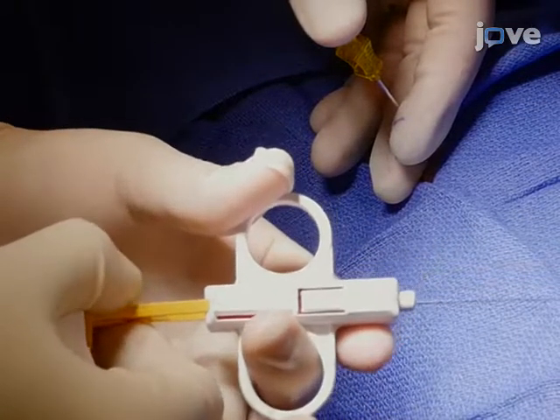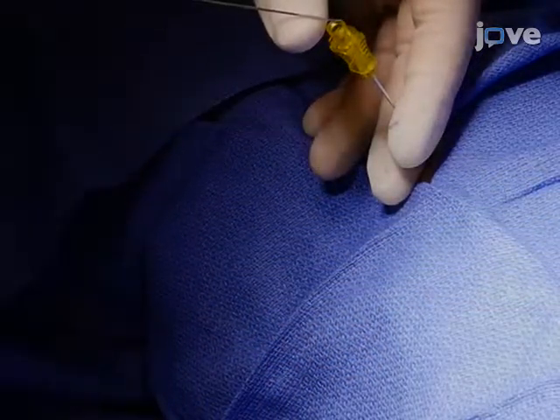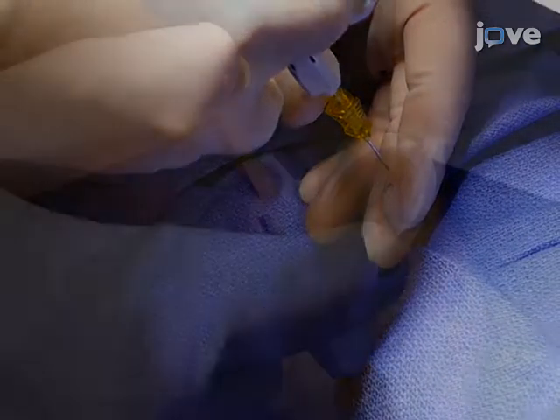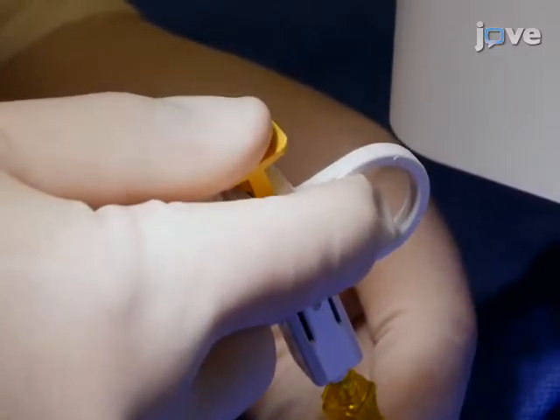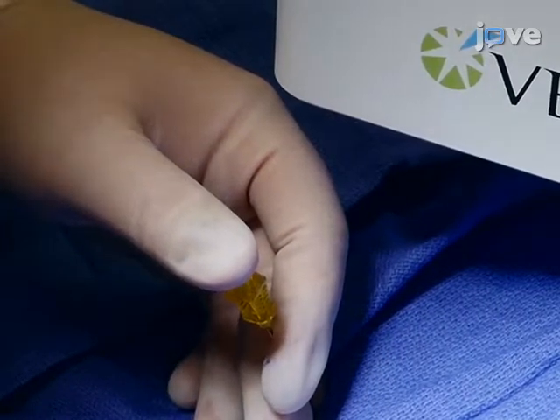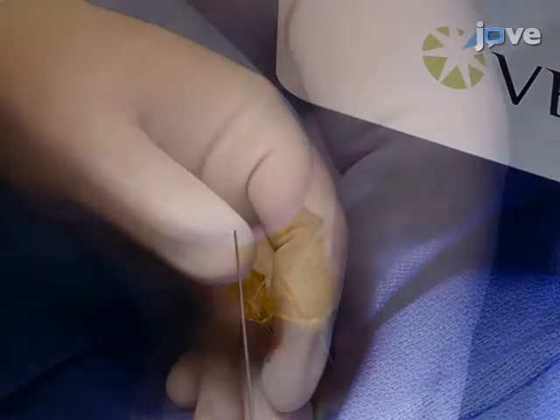Program the automatic needle biopsy to the desired distance or selected length of the biopsy needle based on the size of the lesion. Then insert the biopsy needle through the 19-gauge needle. Stabilize both the needle and biopsy gun, trigger the needle biopsy gun mechanism to perform the biopsy, then remove the gun from the electromagnetic navigational guide needle, making sure it remains in the appropriate position.